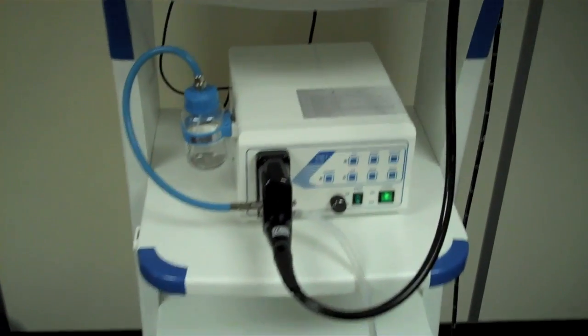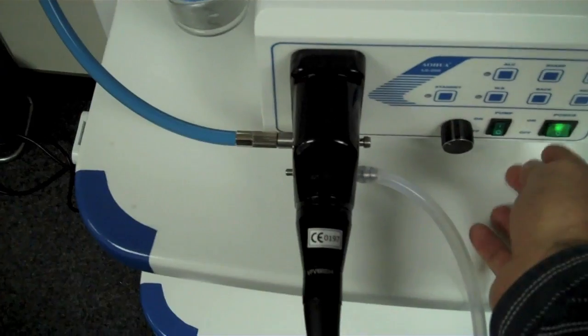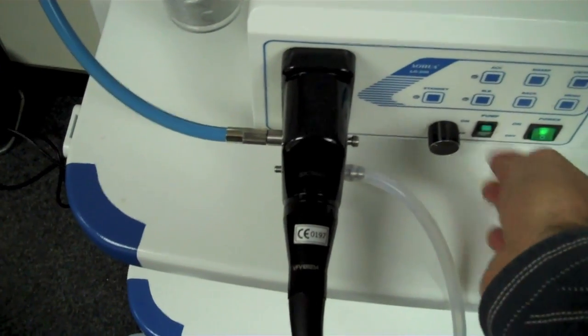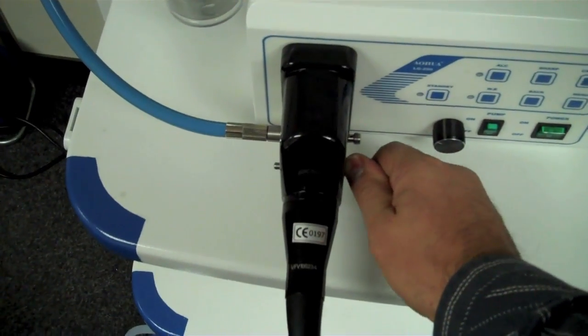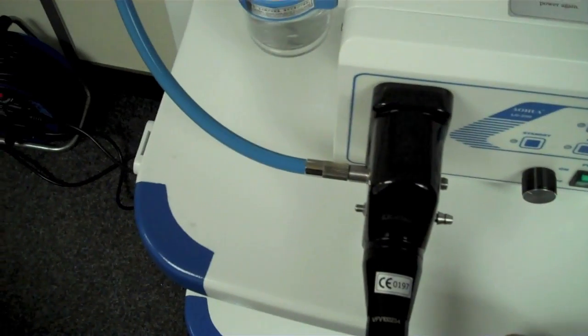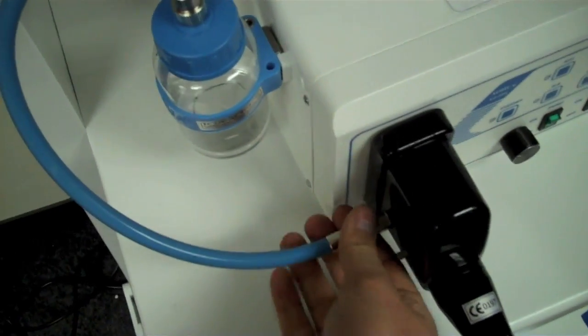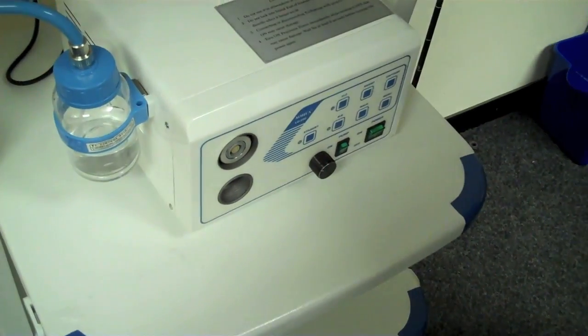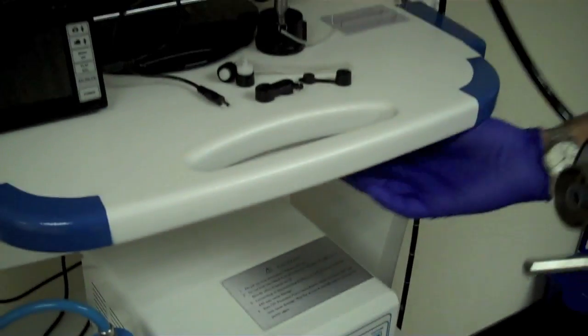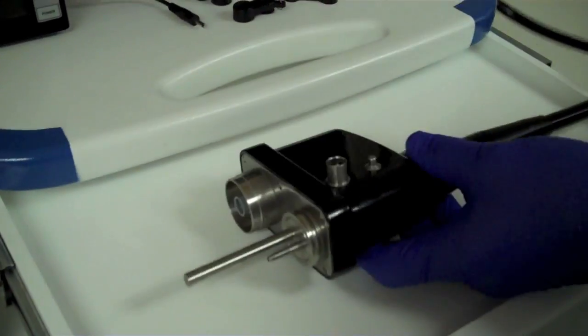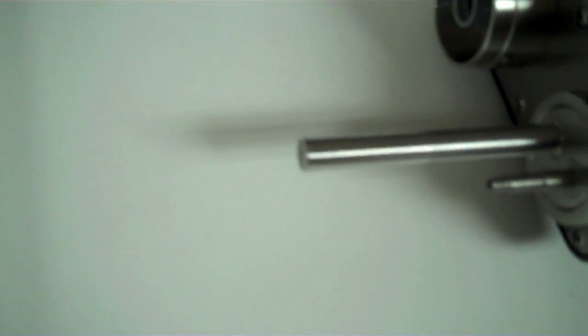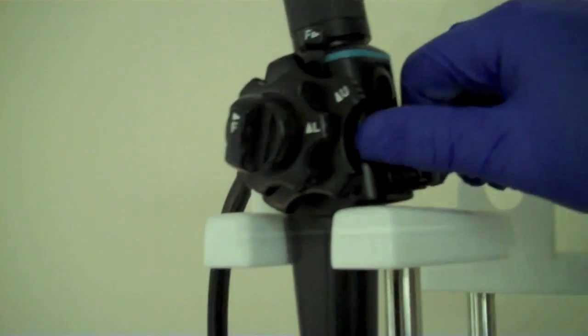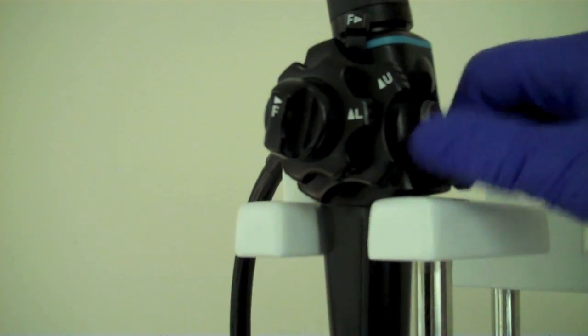Now we just need to disconnect the scope from the pump, the power, take out the suction from the barb and take out the air water supply. Remove the umbilical and place it on the drawer. Do be careful with the light guide because this can be quite hot when it comes out of the light. Now I'm going to remove the suction button and the air water button.